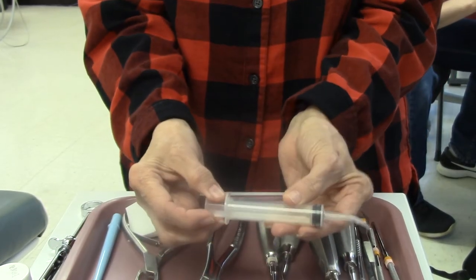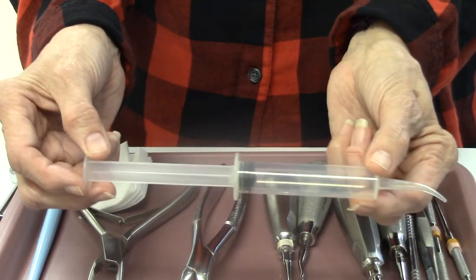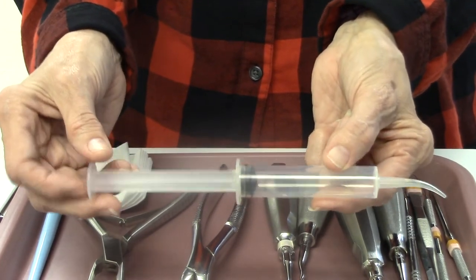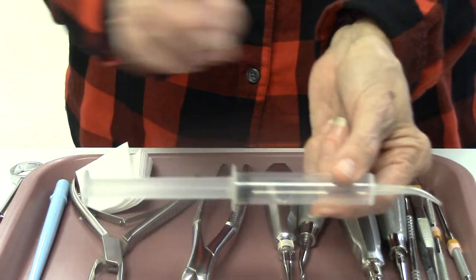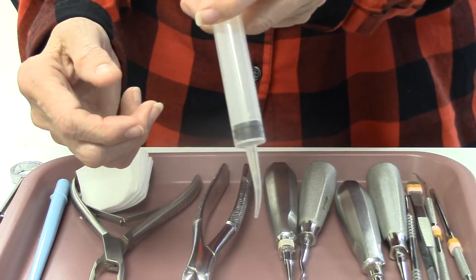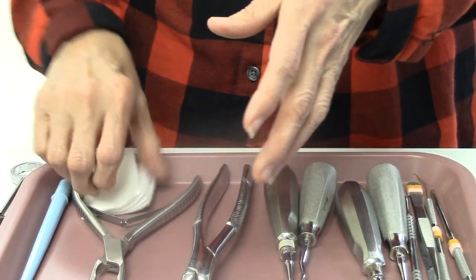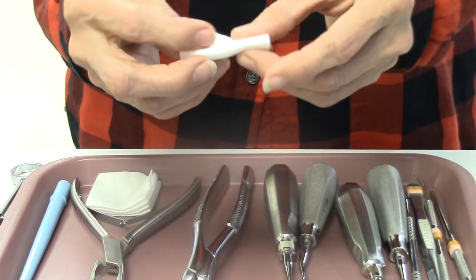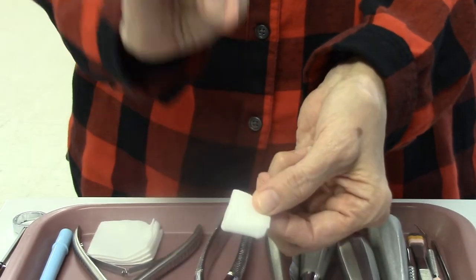This is called the Monoject syringe. This syringe is an irrigating syringe, normally loaded either with a saline solution or an antimicrobial solution called chlorhexidine. The chlorhexidine or saline is injected into the socket and suctioned out with our suction tip. We also have our gauze, which are two-by-twos, folded into a little square and placed in the patient's mouth for them to bite down on.